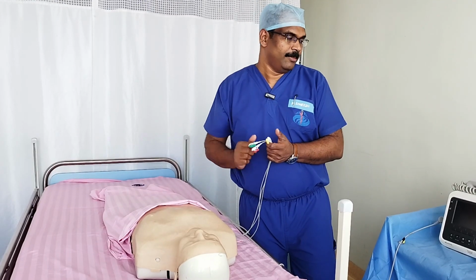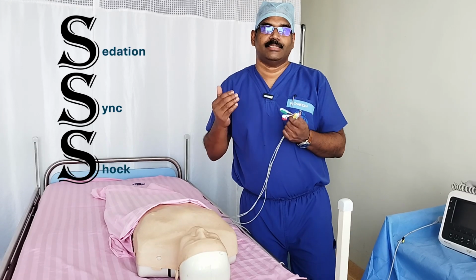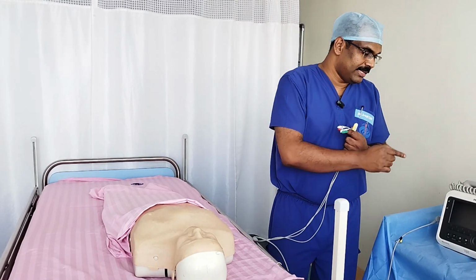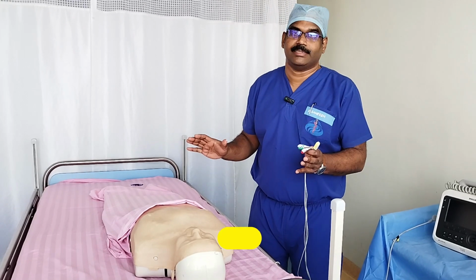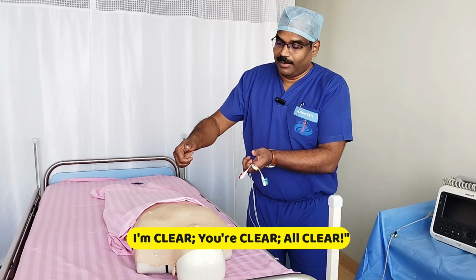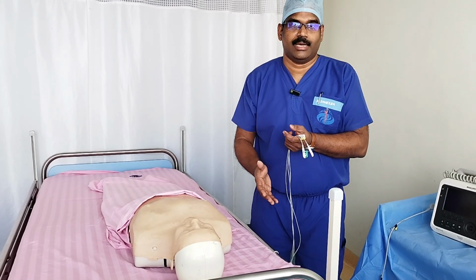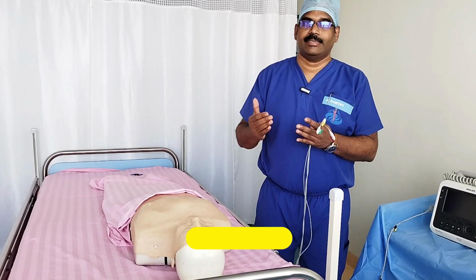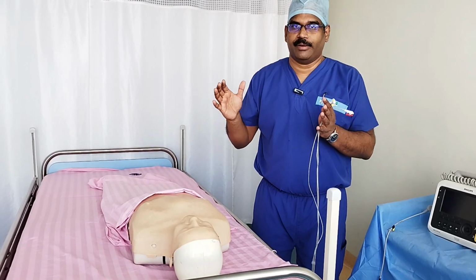This is very important. So once you press the sync button, the last step is shock. So before that, charge the defibrillator. Make sure nobody else is touching the victim. I am clear, you are clear, all clear, and then do the cardioversion by delivering the electrical energy across the heart and then hoping to get an organized rhythm afterwards. So this is the step of cardioversion.